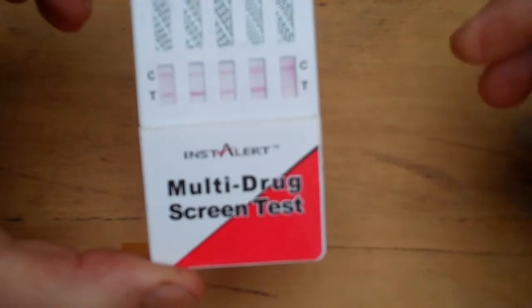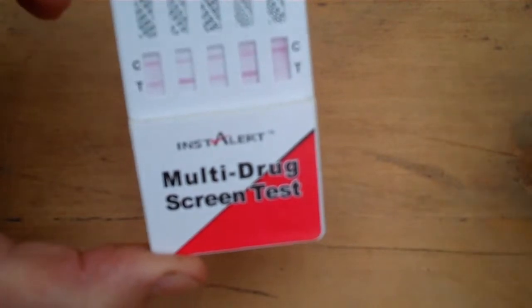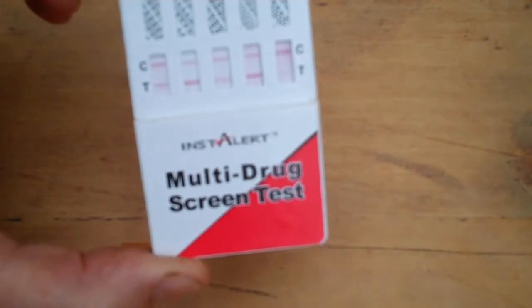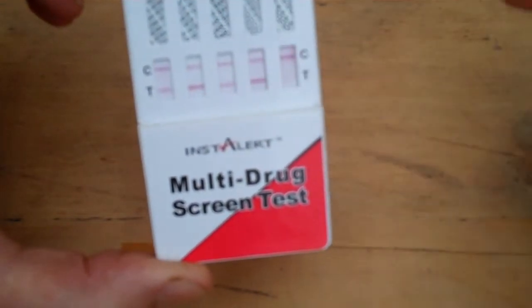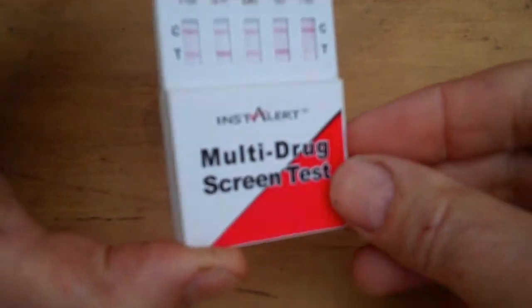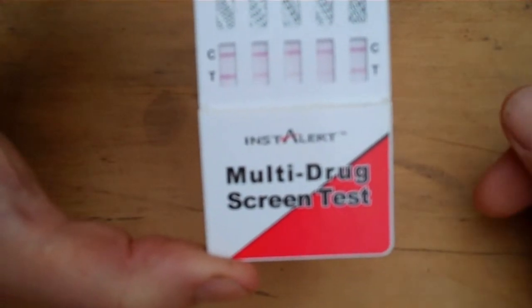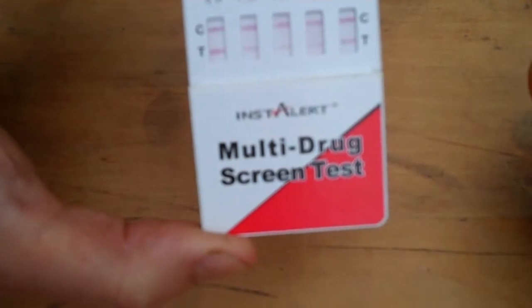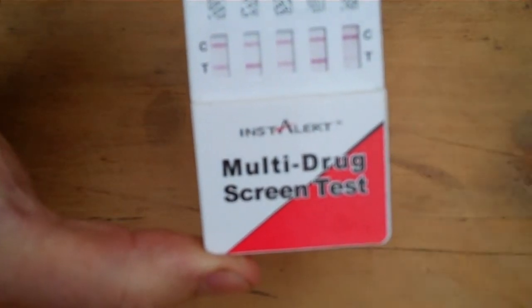Now the beauty of the multi-panel test is that you've got clearly marked on these panels the control line area and the test line area. So it's very easy to interpret. You're looking at individual drug codings on here, MDMA for ecstasy, MOP for opiates, BAR for barbiturates, so it's almost self-explanatory. And you can see on this all negative test result that even now at 1.5 to 2 minutes after applying the sample to it, you can interpret the results on this panel as all negative. You've got control lines showing in every window and you've got test lines showing in every window.